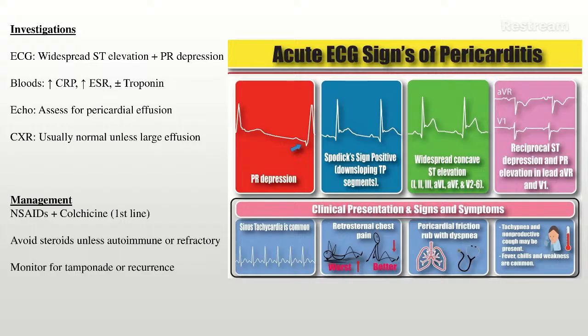So, Tahmid, well done, you are right. So, of course, yes, we'd get a chest x-ray to rule out maybe a pneumothorax, maybe any signs of chest infection. Okay, as you can see here, the signs are all in keeping with pericarditis.